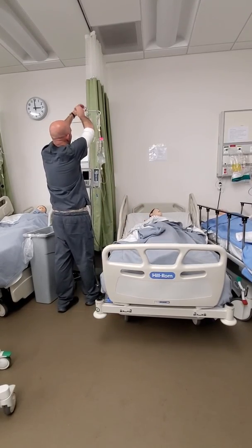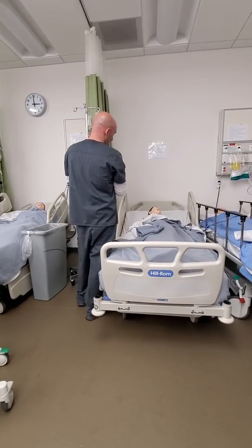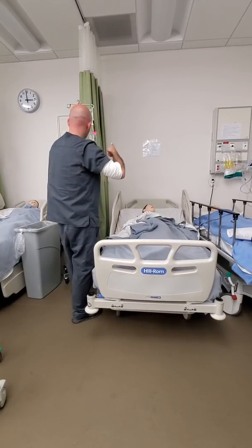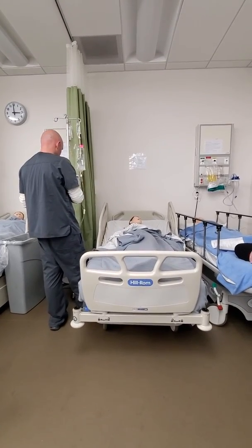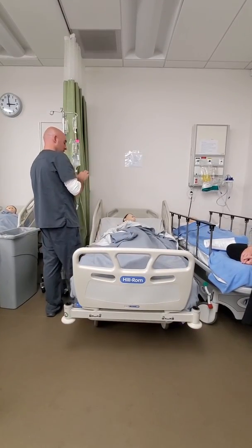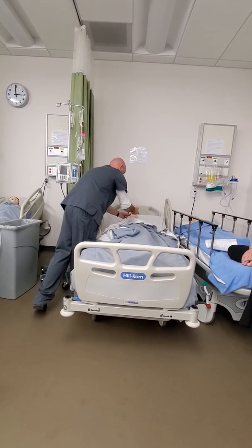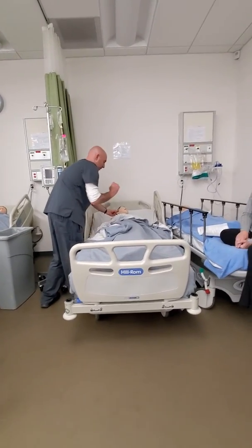So this was hanging up, and it has the sterile cap on there, and I'm ready to flush the port. Then I can take this line down, make a mess of it. Take the cap off, throw the cap away. This is sterile because it has a sterile cap. But hold this up like this. Take this port, clean it for 15 seconds, push pause, and then flush the line.